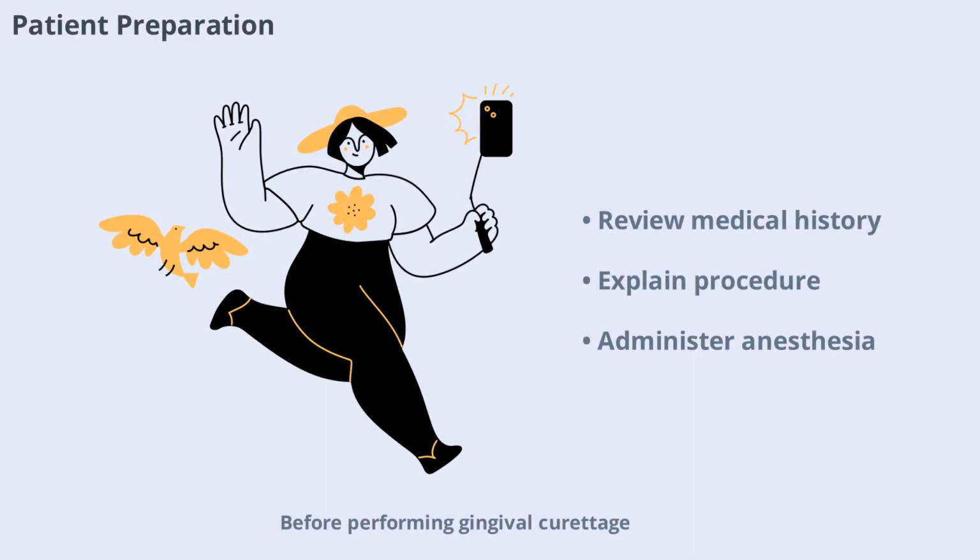Before performing gingival curettage, it is important to prepare the patient. This includes reviewing their medical history, ensuring there are no contraindications, and explaining the procedure and expected outcomes. Local anesthesia is administered to ensure patient comfort during the procedure.